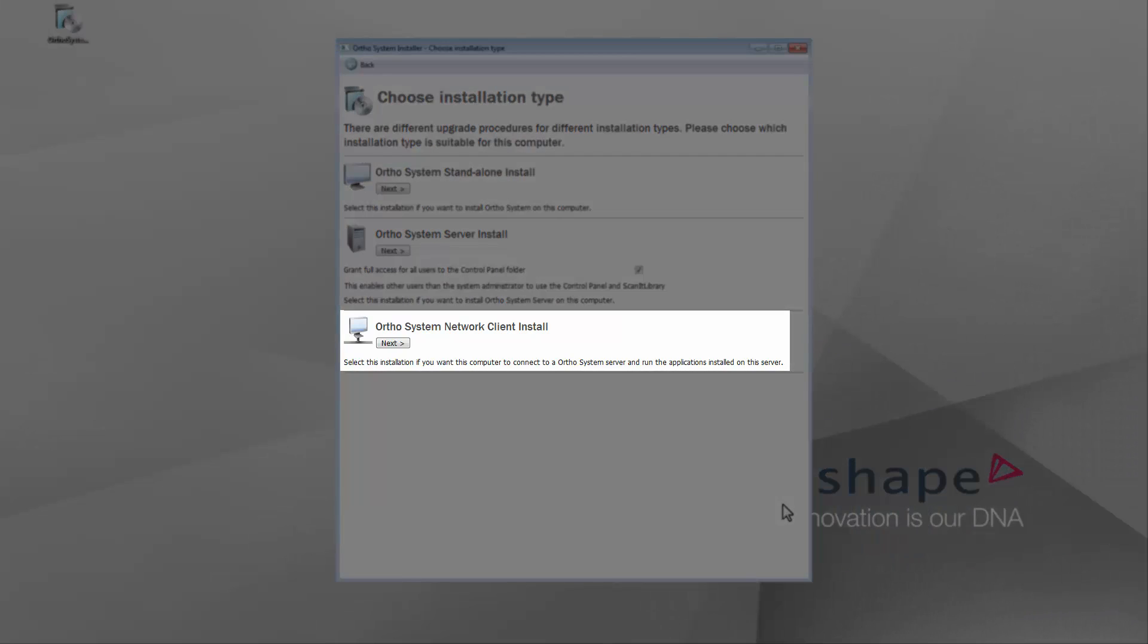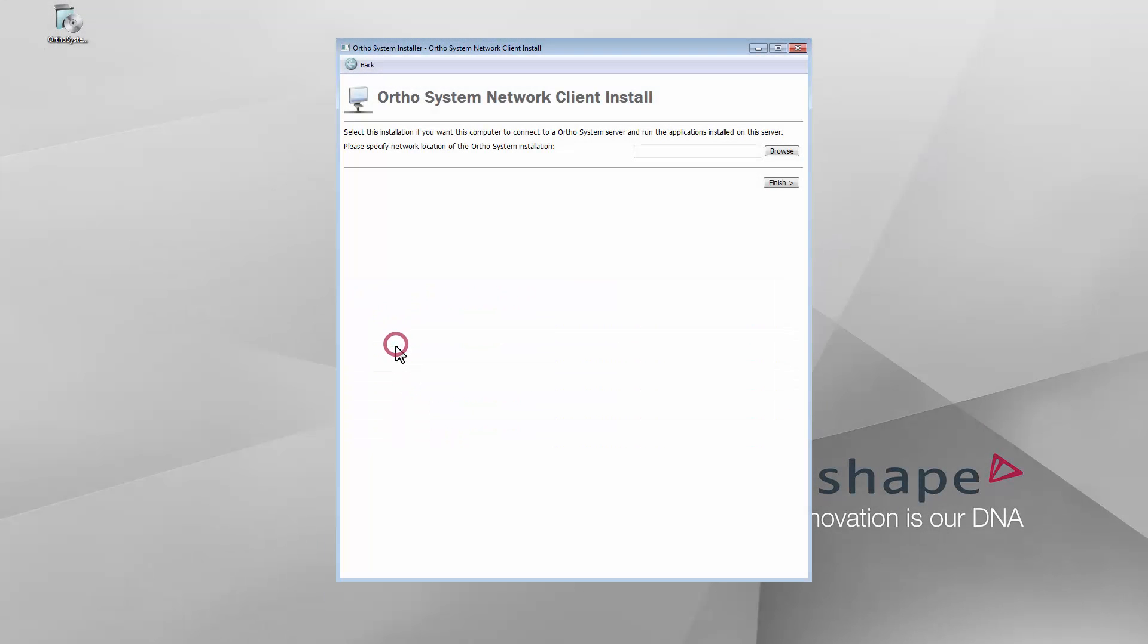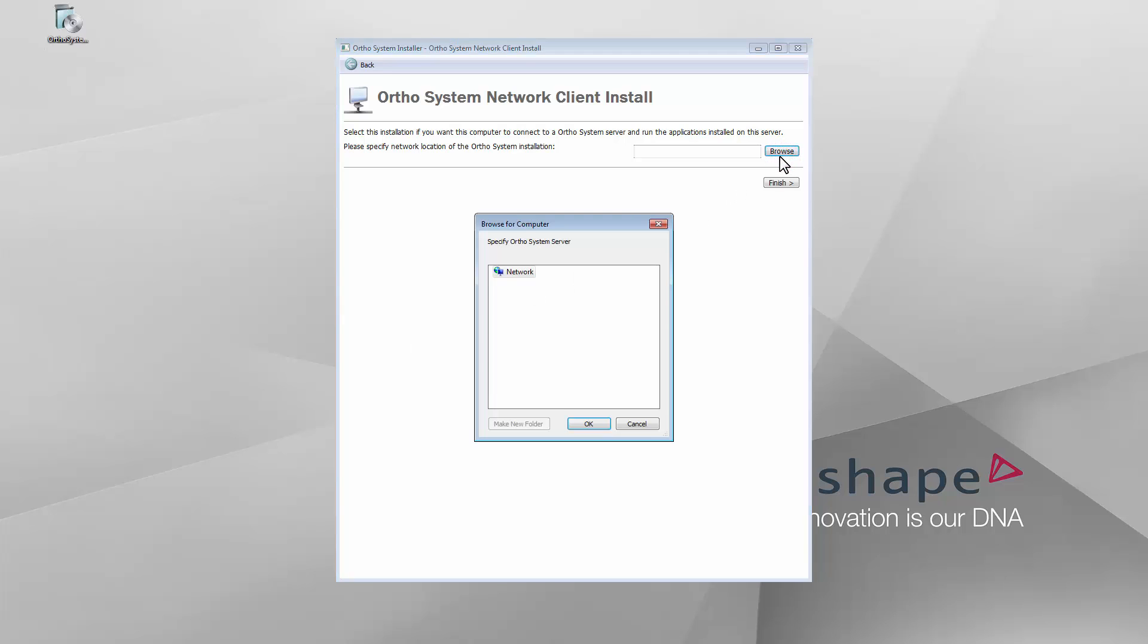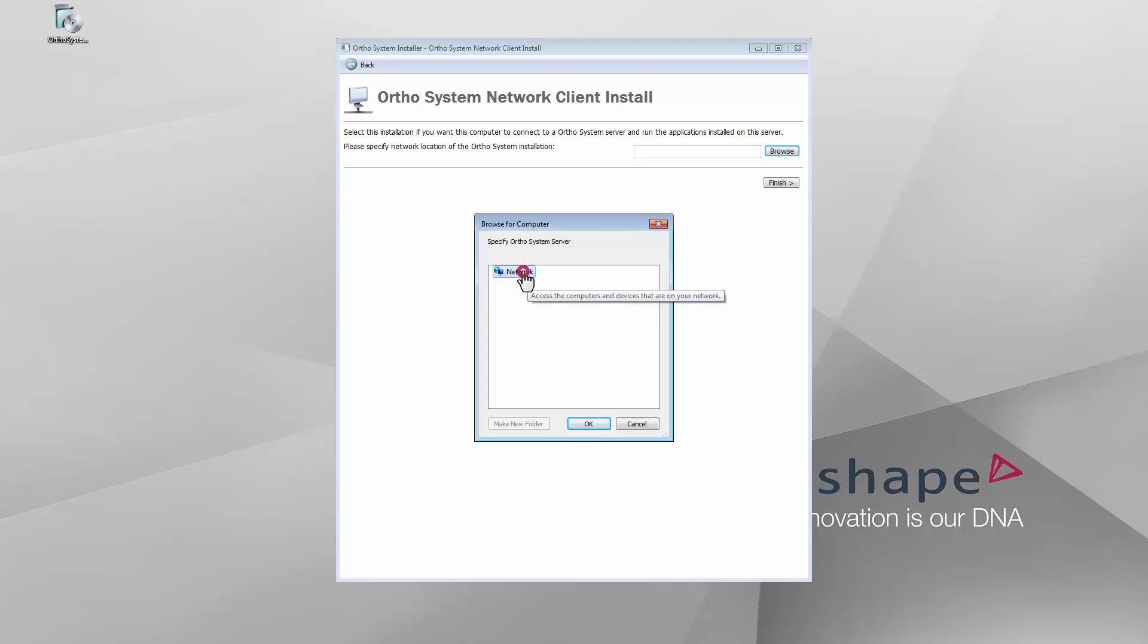In the Installation Type window, click the Next button under Network Client Install. Now you need to specify the location of the OrthoSystem server, which contains the installed applications. Click the Browse button. In the pop-up window, click Network. Please note that you may have to wait a while until the list of the PCs in your local network is refreshed.